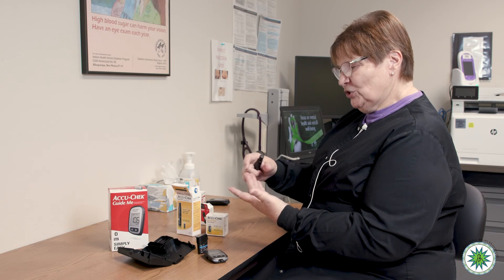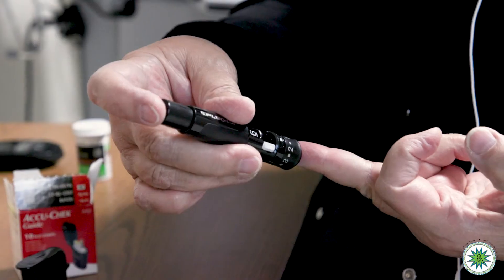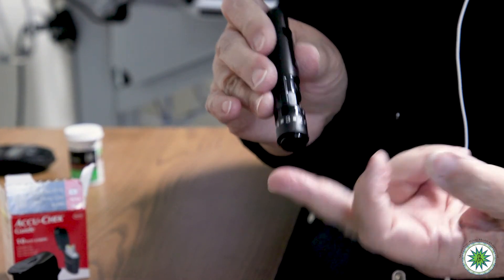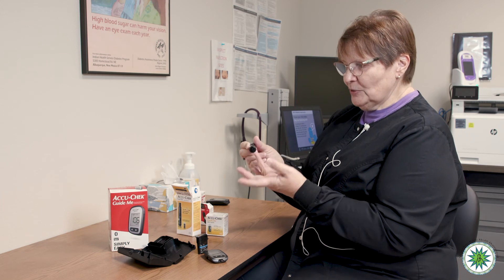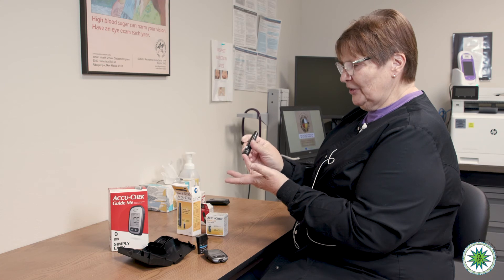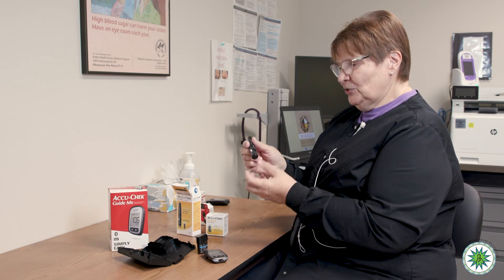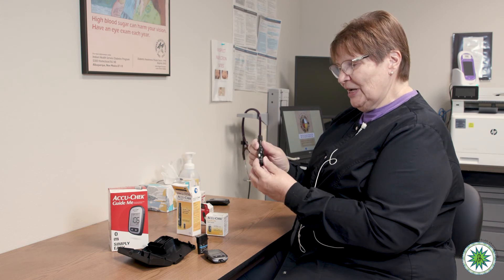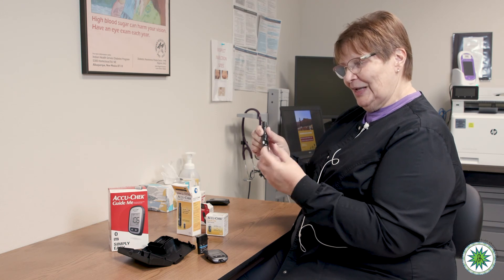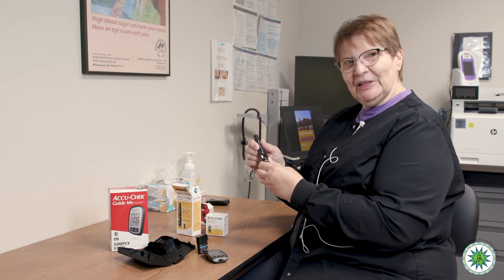You want to puncture your finger on the sides — at about 10 o'clock and 2 o'clock, if the end of your finger were the face of a clock — not right on the fingertip. The lancet needle comes out of the little hole, so you want to line it up and press it firmly and flush against the side of your finger. There's just one motion that punctures your finger. You can use the device once and then advance it — the drum has six different lancets. When it goes all the way down to one, you replace the lancet drum.